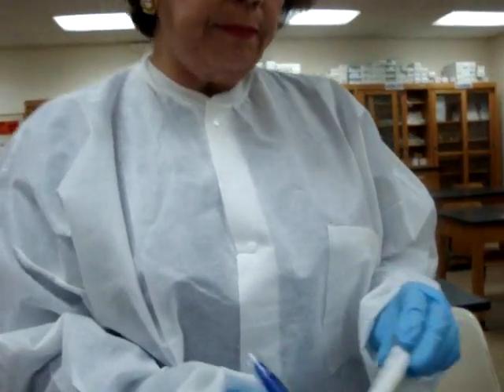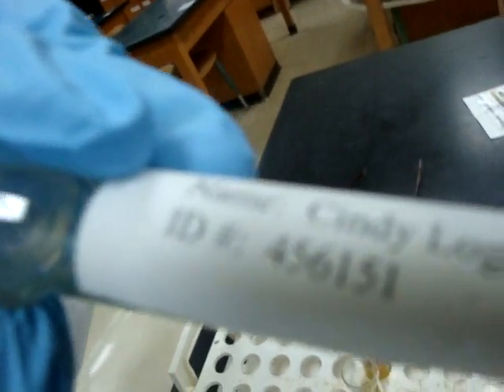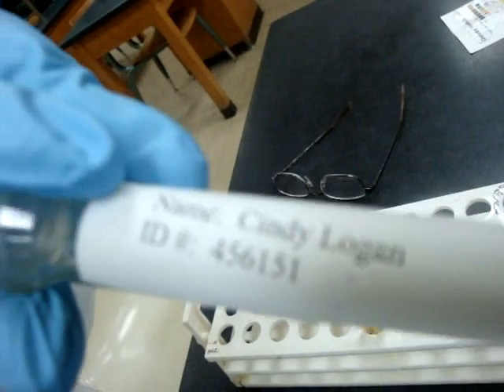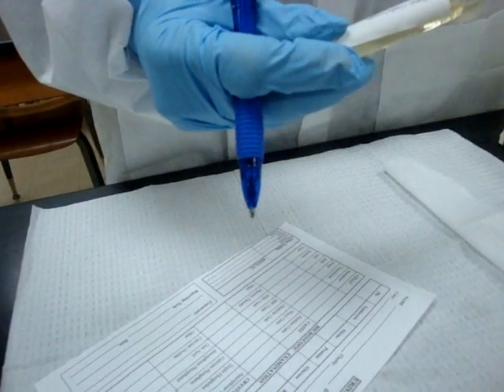After we finish our quality control we're ready to do our patients. When we do our patients they will always be marked with the name, the age, the sex, and an ID number. Be sure to record all of this on your requisition sheet before you begin to do your urinalysis.